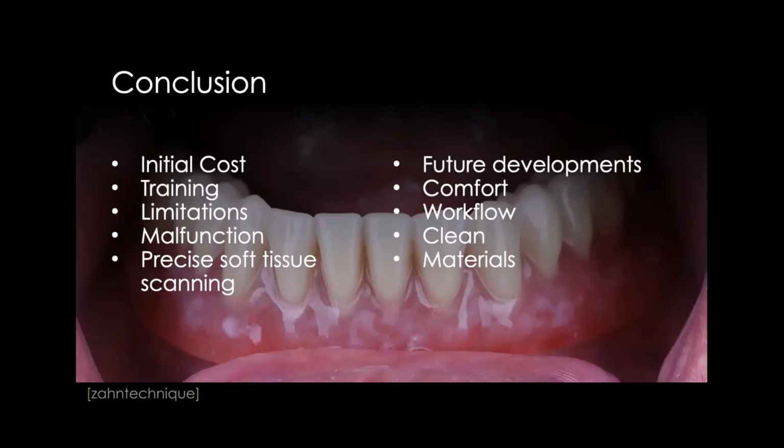And the other issue here may be precise soft tissue scanning, because you cannot get the same compression of the tissue with a scanner as you can with a regular impression.